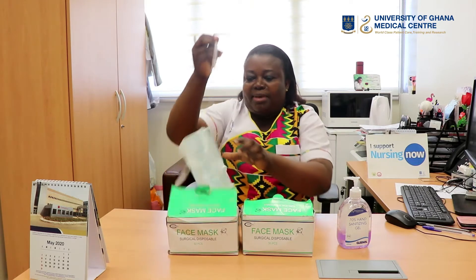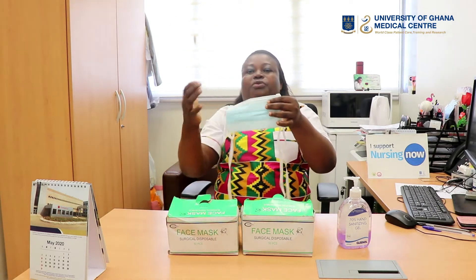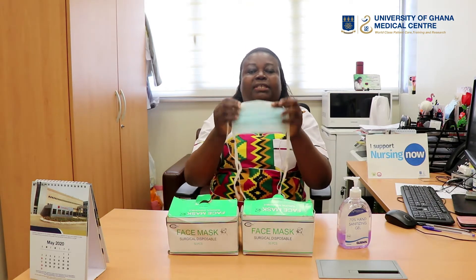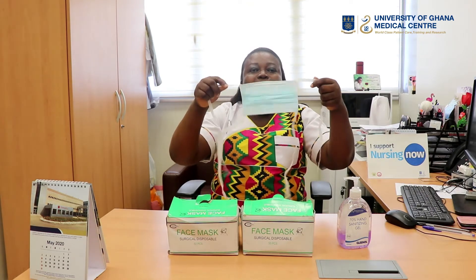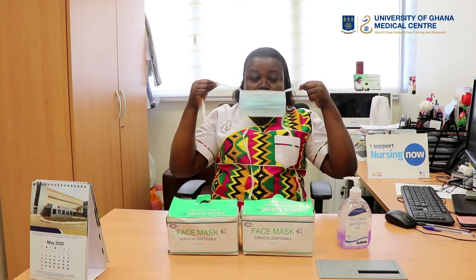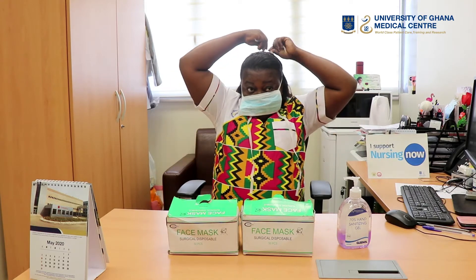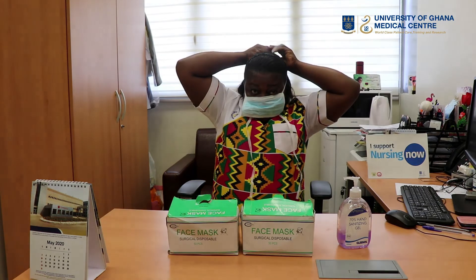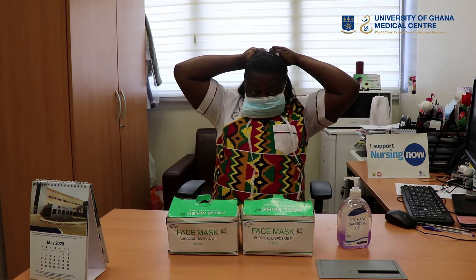I'll now pick my string face mask. It has a string at one of the edges, so make sure that one is facing upwards as it will fall on the bridge of the nose. You hold it by the strings, put it on your face, and it falls on the nose and the mouth.